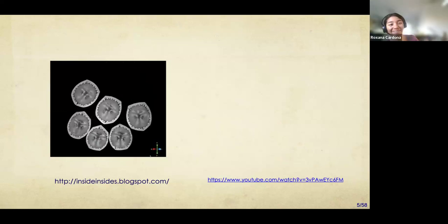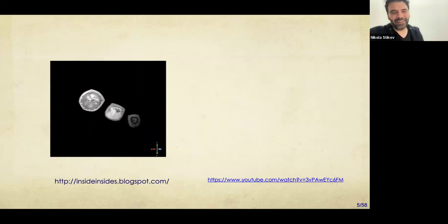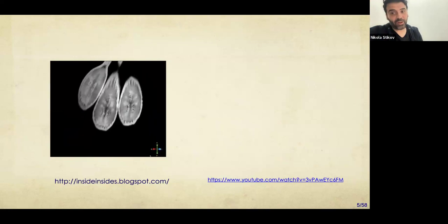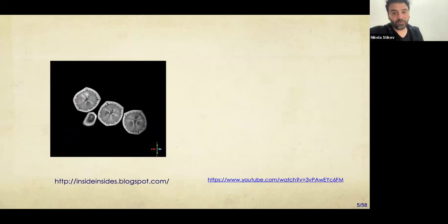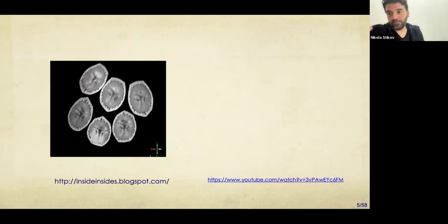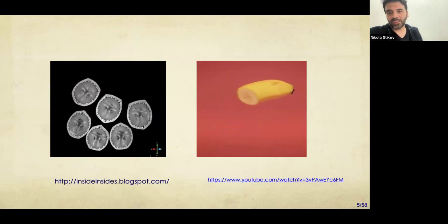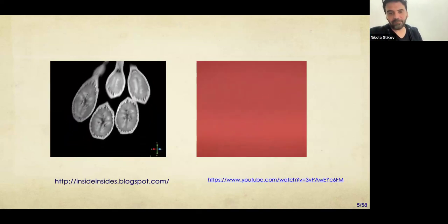It's a fruit. A banana? Yeah, or 6 bananas in this case. Yeah, so that's something that hopefully orients you to how we look at MRI images. We're basically doing cross sections, but we're not cutting through the fruit. This is a whole bucket of bananas that's just imaged, and this would be the equivalent of how we're looking at it, except we're not really cutting it.